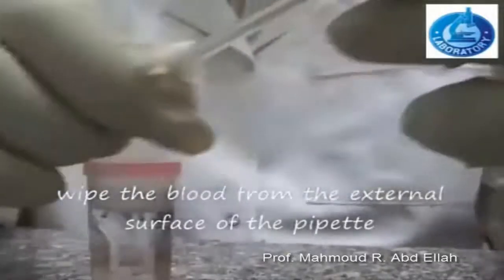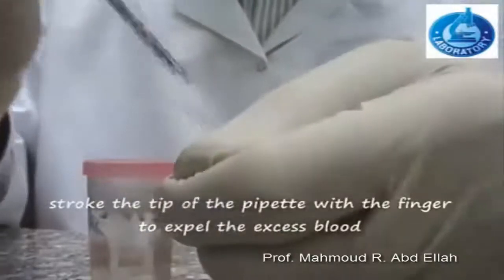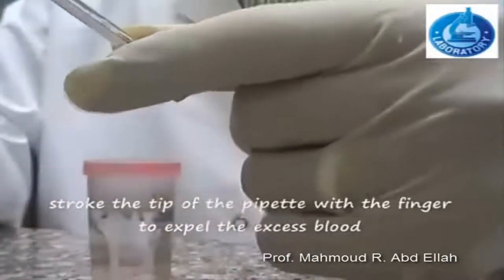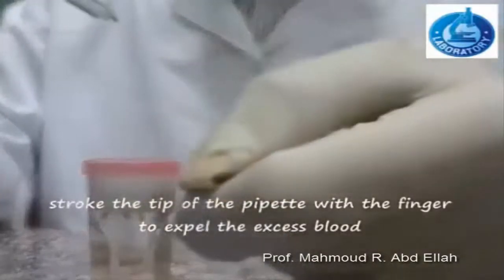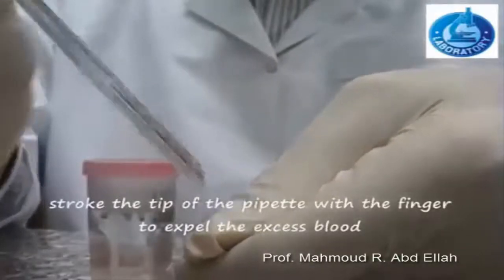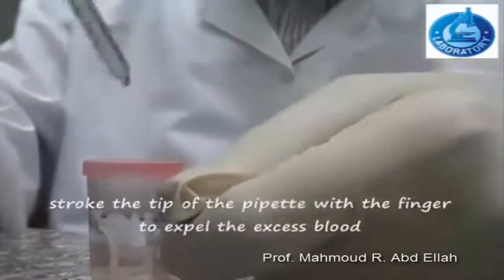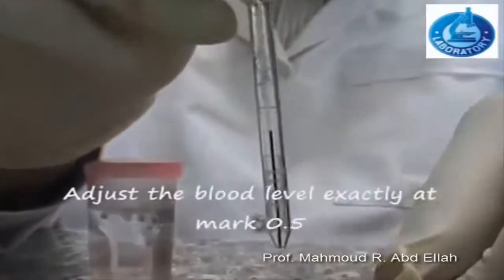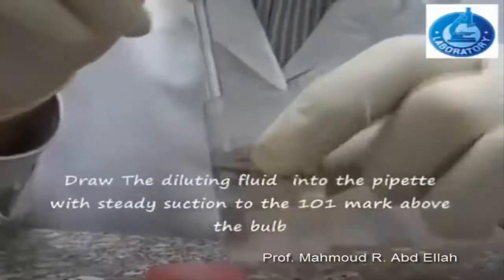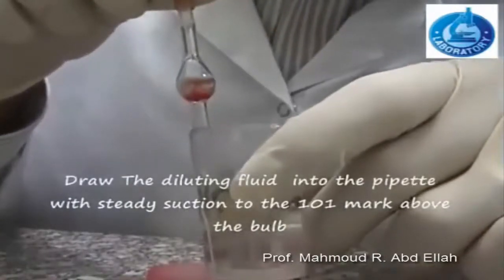Wipe the external surface of the pipette from blood. Then expel the excess blood by stroking the tip of the pipette with the finger, so that the mark of the blood in the pipette becomes equal to mark 0.5.